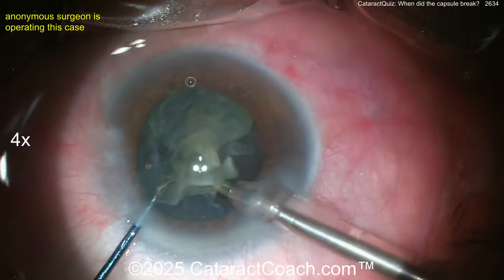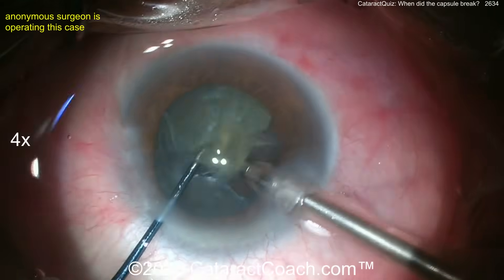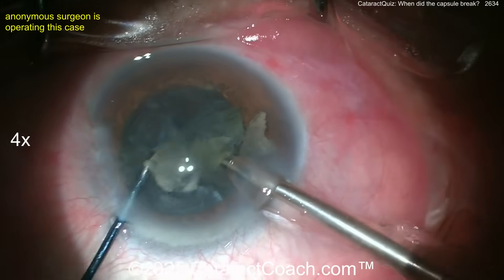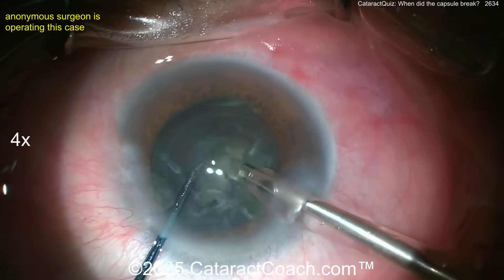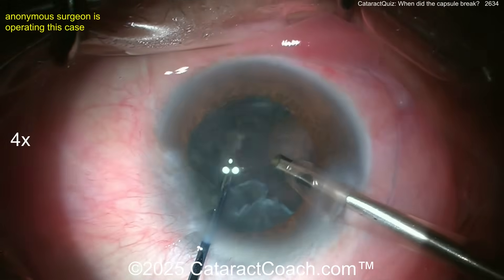Buzzing in now on the second half, with a good chop — bringing the pieces up. Very good control here; the surgeon is doing a fantastic job keeping everything stable. At this point the surgeon may not even realize the capsule is open, because that snap sign — as Ronald Joé taught us 30 years ago — is very subtle.